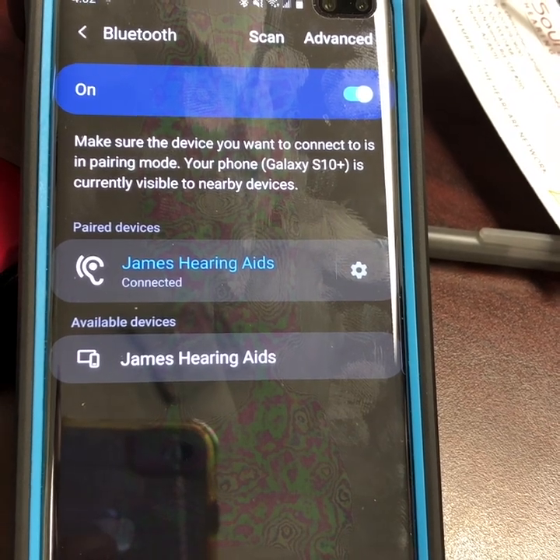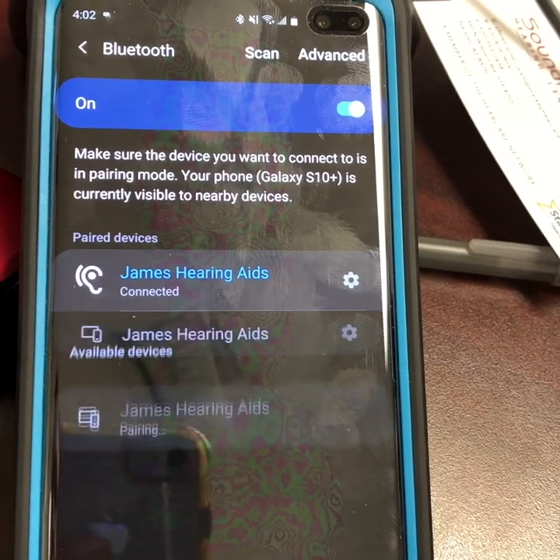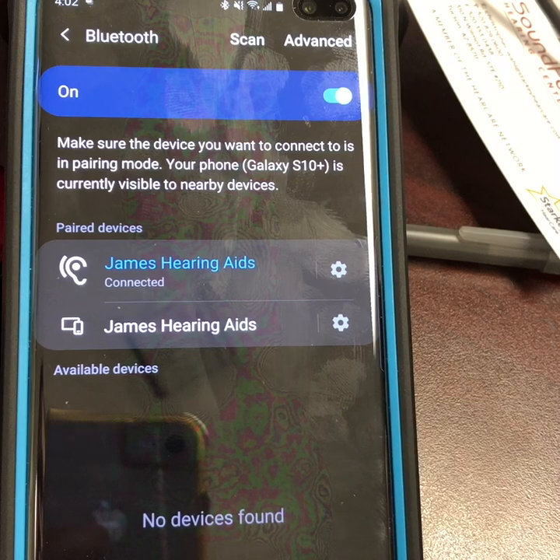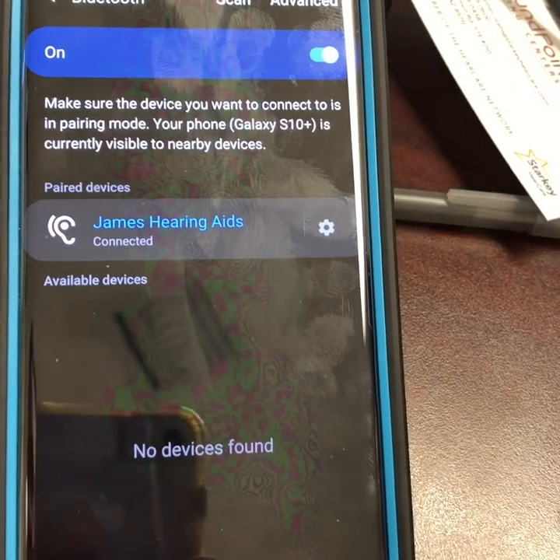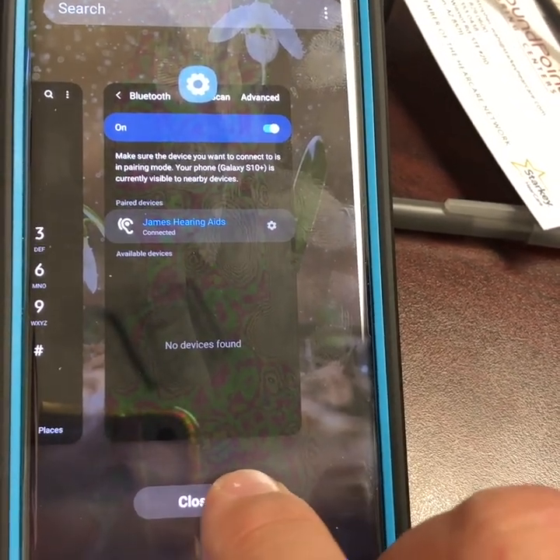When exactly 30 seconds has elapsed, touch the second hearing aid — it pairs it. Watch: they will become one. If you've done it successfully, you've now paired your made-for-iPhone hearing aids to a Samsung Galaxy S10 with a 10 operating system.